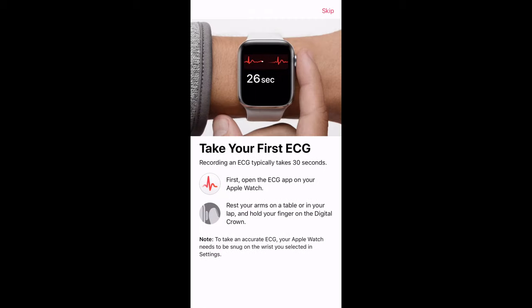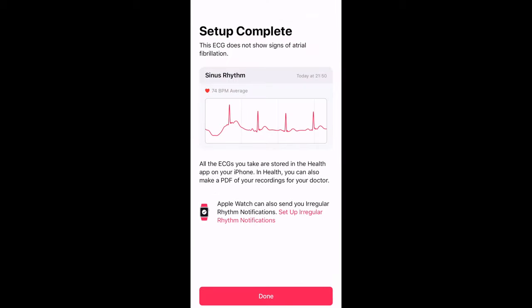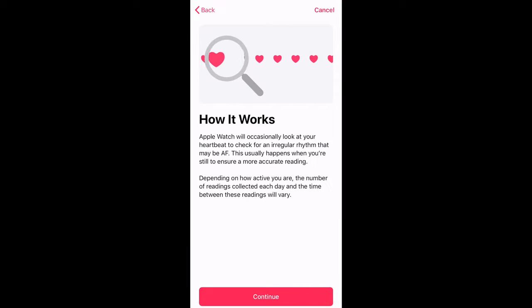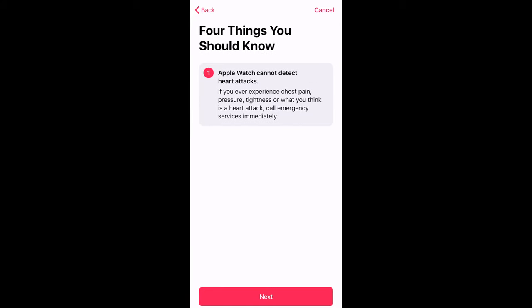Moving on to how to take your first ECG — you go through options like your date of birth, and then you'll see the screen to show setup is complete. Next you'll see how the actual ECG works, showing you information on how it collects data and how it notifies you of things — four quick points you should know.